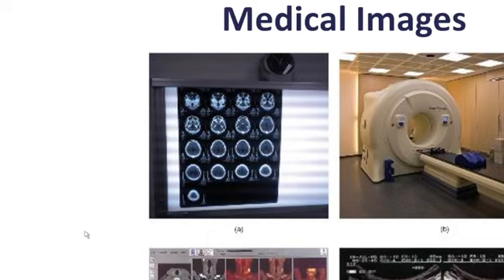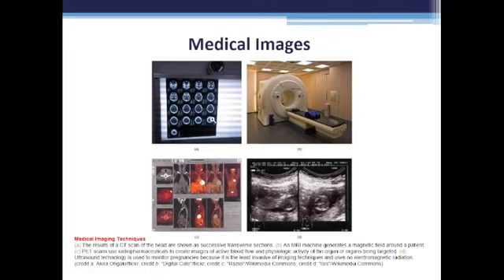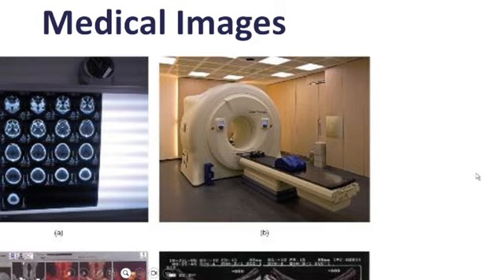Next one is the MRI machine. The MRI machine is this. It creates a magnetic field, and it scans patients using electromagnets and radio waves.